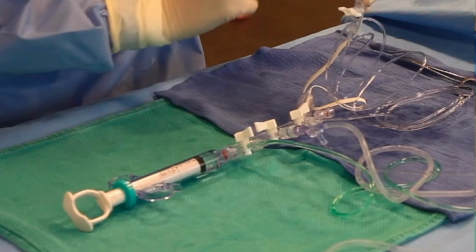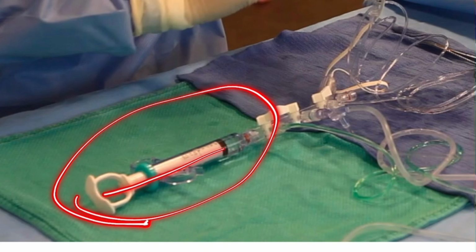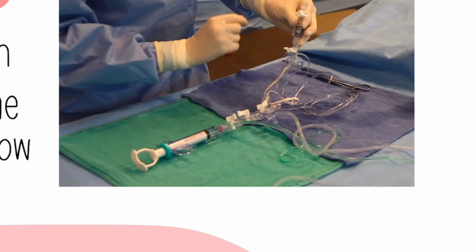But if you see, it has a body, several different knobs. It connects to the catheter here, which would be going in the patient's body. And then there is a transducer that transduces that mechanical pressure into the electrical signal that you see on the screen. Then you have a control syringe. So this is where you're injecting and aspirating and pulling back.